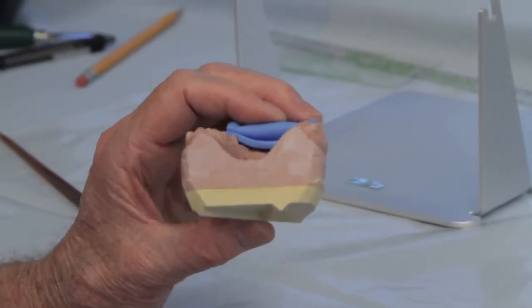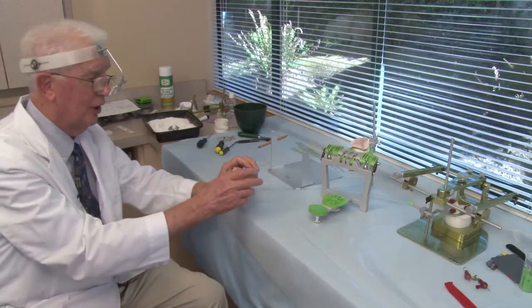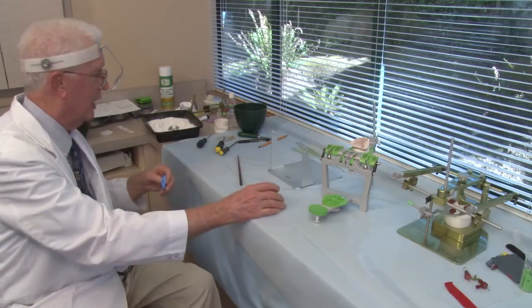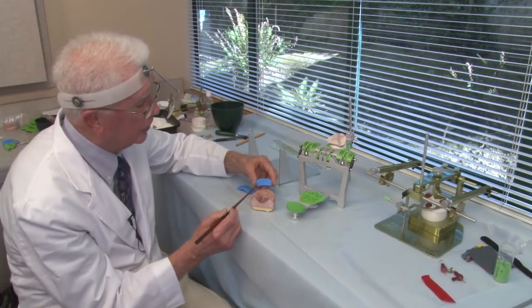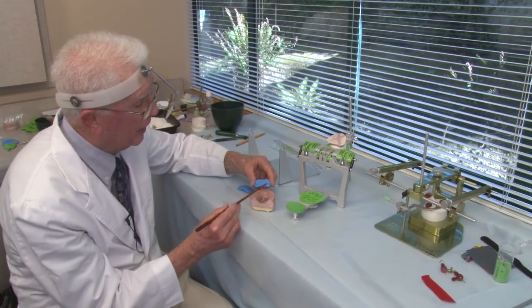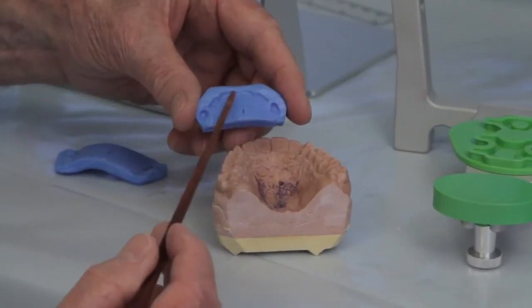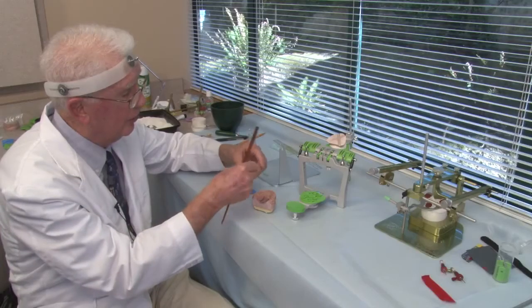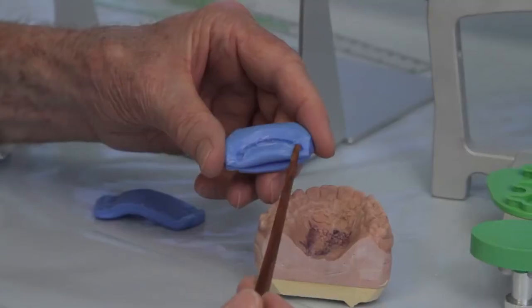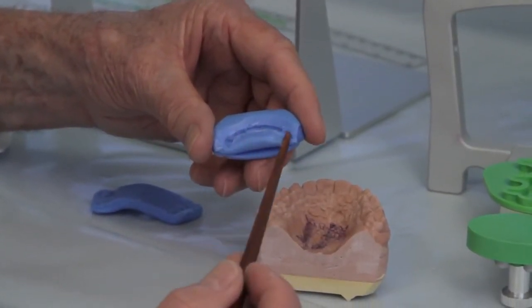Am I clearing soft tissue? Well, I can't tell for sure. So I'm going to make really sure I clear by cutting away the excess wax. Okay. I've used a sharp scalpel, and I've cut away the blue wax all in this area here, and a little bit on the labial of the canines. And I also cut some on the lower incisors. Cut away the wax in here so the indentations wouldn't be quite so deep.